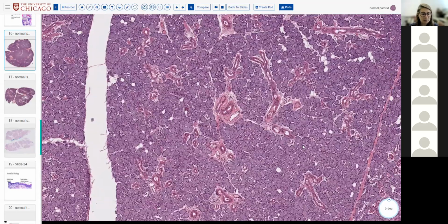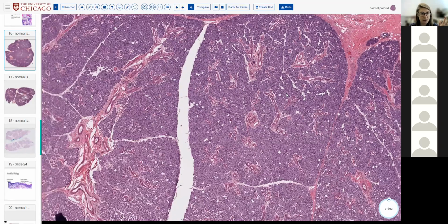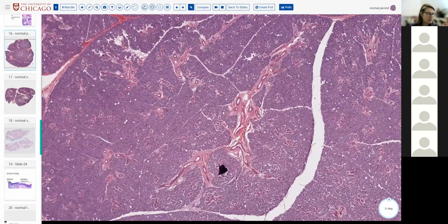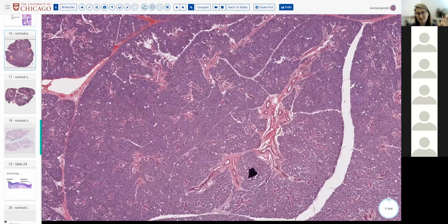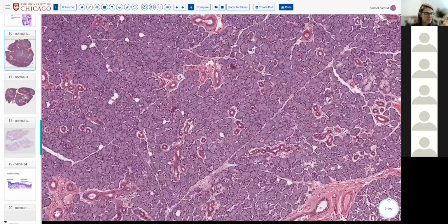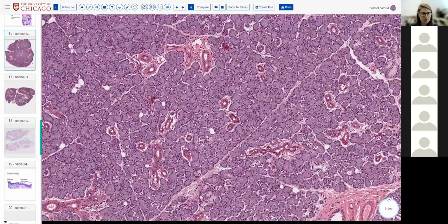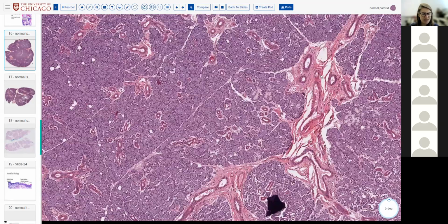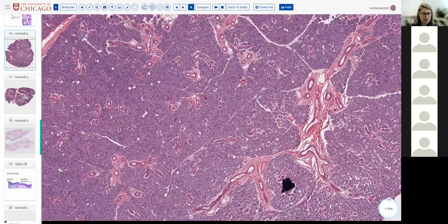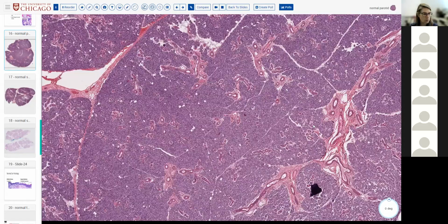Salivary glands, right, not only contain acini, but they contain ducts, right, with which to shoot out their secretions, to be crude. So there are many sized ducts in the salivary gland, ranging from these small intercalated ducts that feed right out of the acini into these larger ducts, and then into these very large excretory ducts that secrete out into the actual external world, right?